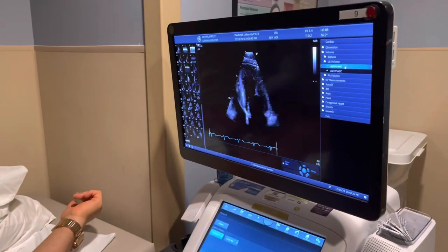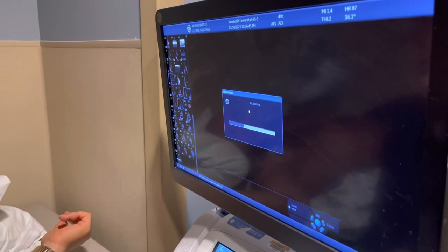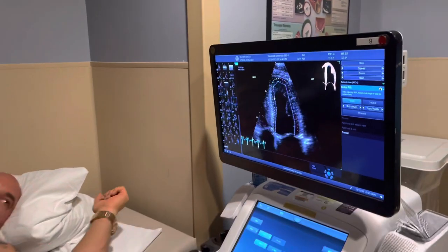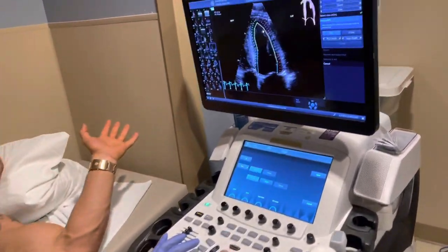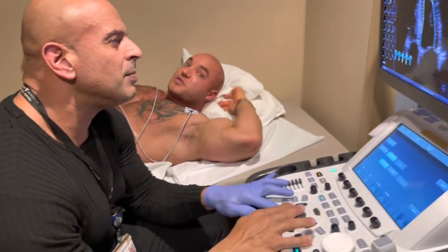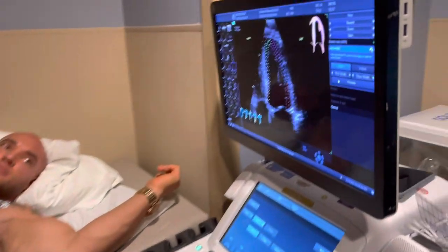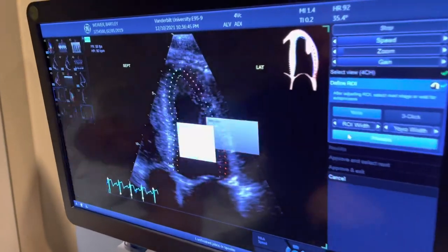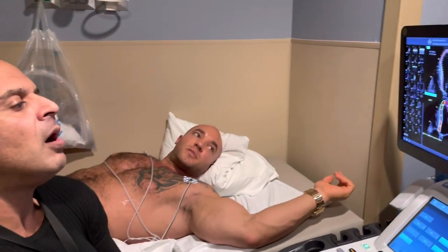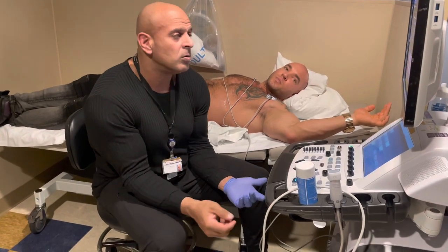We're going to do what's called a strain analysis — looking at your left ventricle in three different angles. With bodybuilders and the amount of tension and working out daily, you could probably notice something. The main thing with bodybuilders and this test: unless you had a heart attack, I can see damage. Or very high blood pressure — that's prevalent in bodybuilding. And coronary artery disease is very common in bodybuilders who use anabolics — that's the number one issue with bodybuilding today, unfortunately.